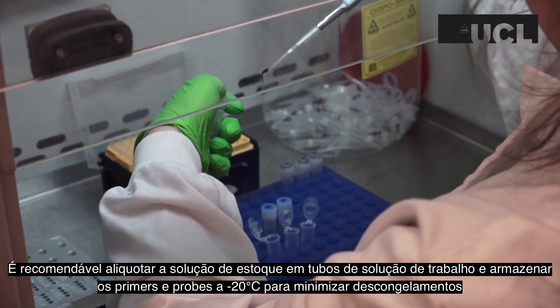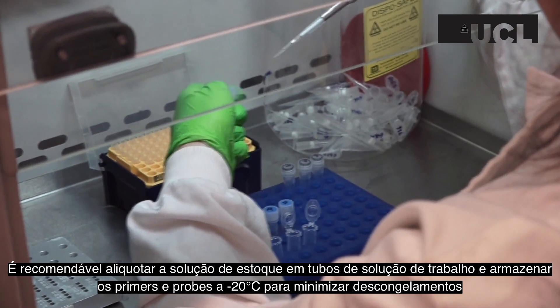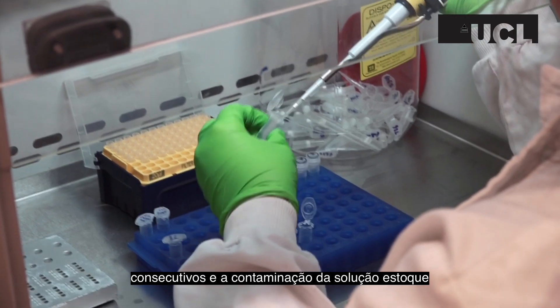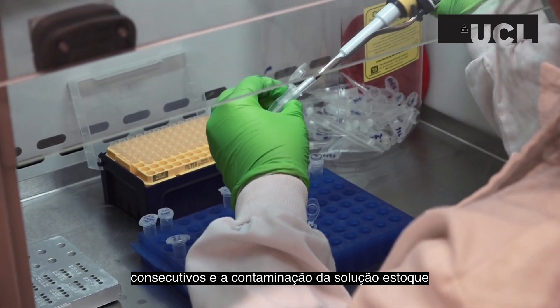It is advisable to aliquot some of the stock solution into microtubes of working solution and freeze them at minus 20 degrees, to minimize freeze-thawing and contamination of your main stock.